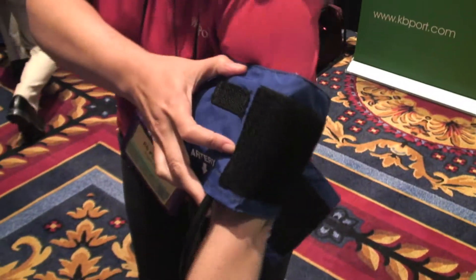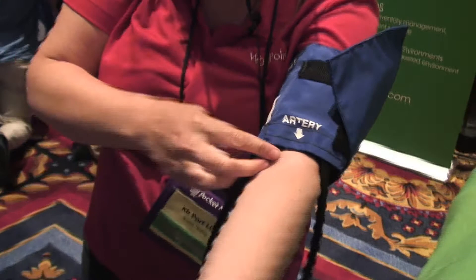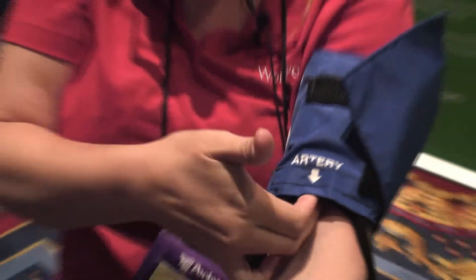You put it around the person's arm, following where the artery is, and place the stethoscope directly on the skin. Based on the technology we have, the sound plays through the skin, which overrides the real heart rate and blood pressure.